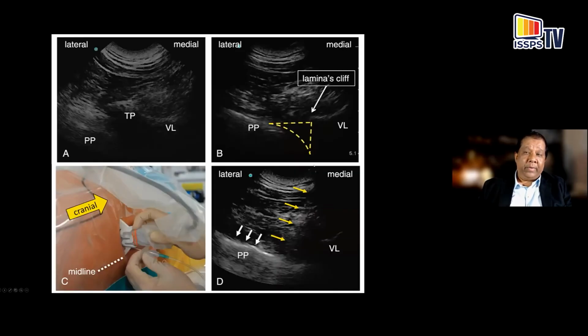While it is a general practice, I have always taught that we should not go close to the foramina, but Dr. Takeda has changed my practice. It is indeed maybe beneficial in some respect, and I will present some of his data. You can see this triangular wedge-shaped space. The needle is inserted from the medial aspect of the transducer, and because this is a microconvex, you can see the paravertebral outlines, and the needle is inserted using a guide from the medial aspect, and then you place it where the paravertebral space is and look for pleural displacement.